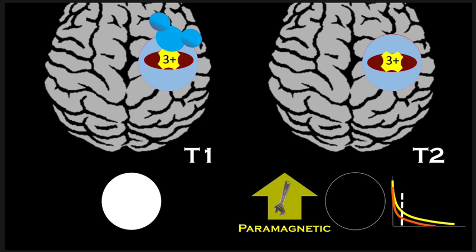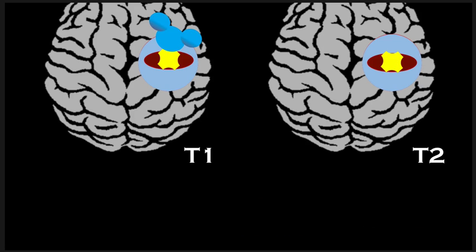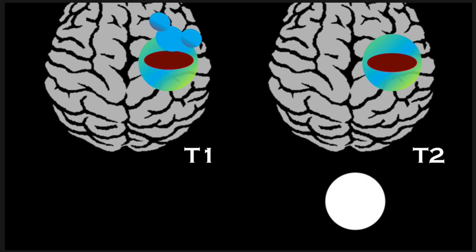And then after about a week or so, the cell is going to start to break down and rupture, and all that intracellular methemoglobin is going to bust out and sort of dissolve around and get diluted and become homogeneous again. And as that happens, we're going to have a more homogeneous field. So we've got all the runners that are sort of identical twins now. So that's going to bring us back to a regular T2 instead of that T2 star.